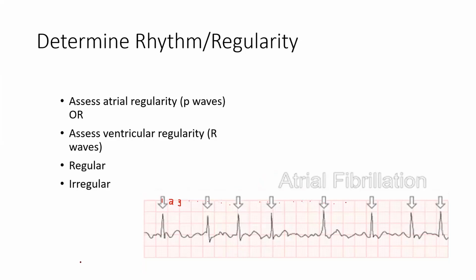So here's where I talk about irregularity. Let me erase these. And you'll see for this patient, 1, 2, 3.5 blocks between these, but then there's only 2.5 between this one. Now we're back up to 3 blocks in between. This one has 4 blocks in between. This one has 3.5 blocks in between. Okay, there's really no regularity at all. This one is actually called atrial fibrillation, which I'm not teaching you here today, but it does have a good example of what an irregular heartbeat looks like.